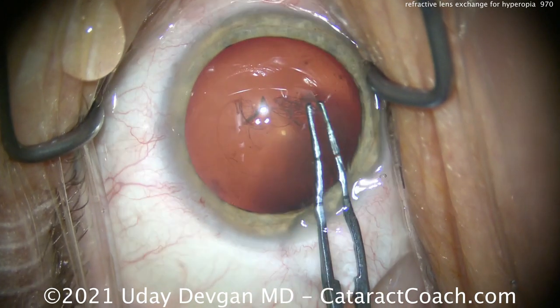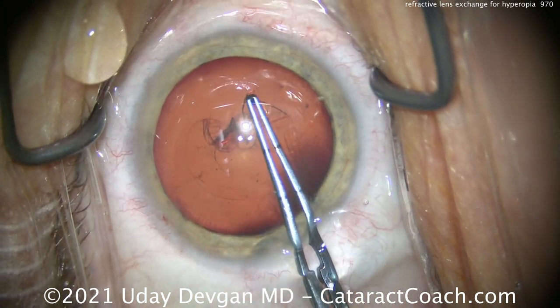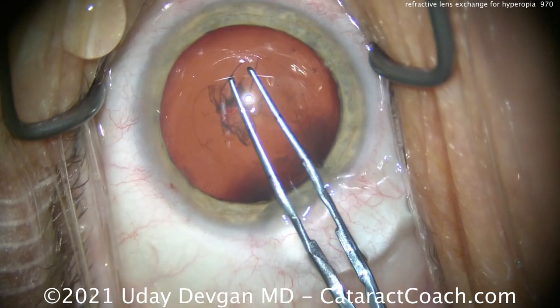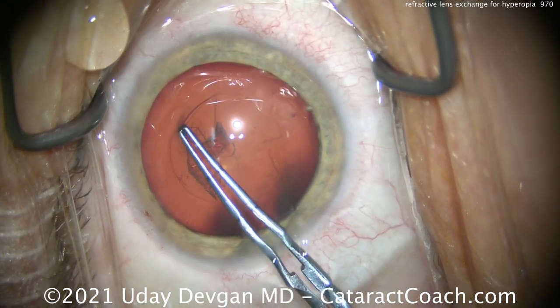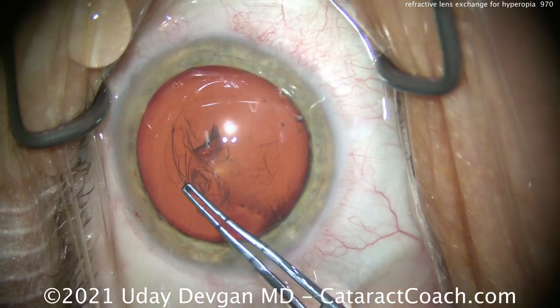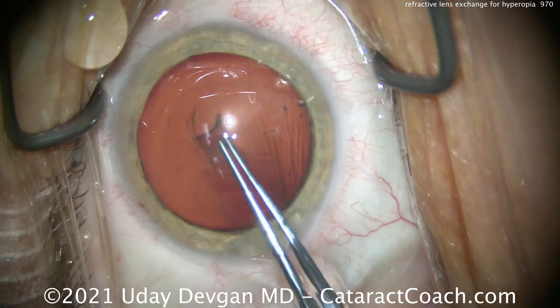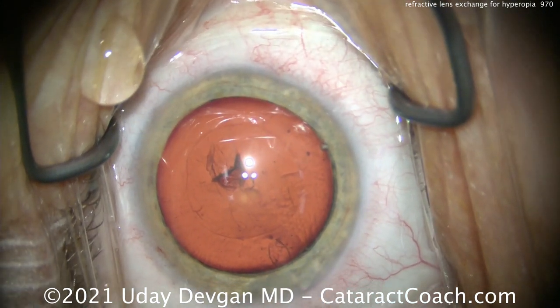So we have to constantly be vigilant about bringing that capsule tear inward to achieve that round 5mm or 5.5mm capsulorrhexis. Look at the angle in which we're using the forceps — it wants to run out, but we're going to bring it back. And we're able to successfully create this nice 5mm rexis. There it is measured — beautiful.